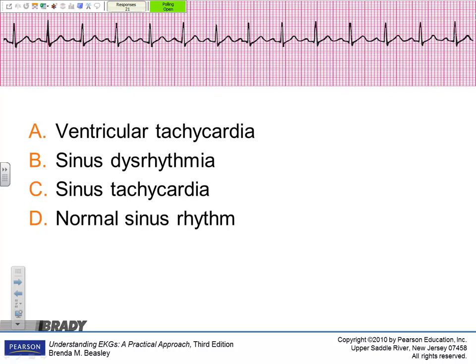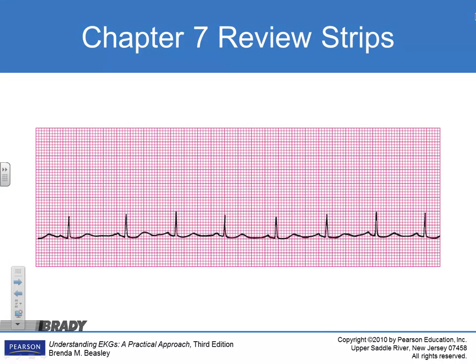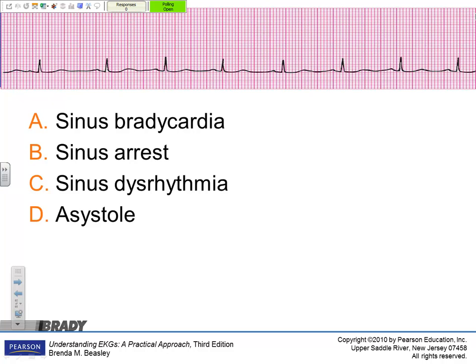Ventricular tachycardia, for it to be a ventricular rhythm, what does that QRS have to look like? A big old fat nasty one, yeah. There's no big old fat nasty QRS on there, so it cannot be any kind of ventricular rhythm. All right. Okay, what's this one?